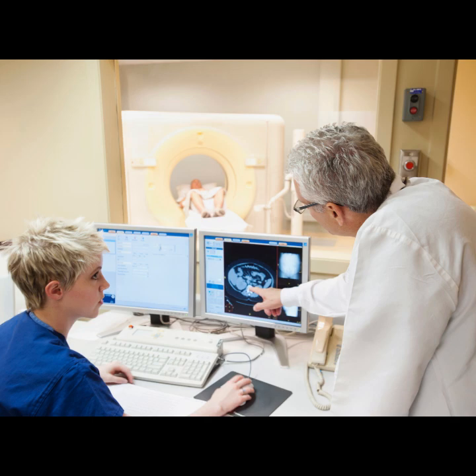Welcome to the debate. Our focus today dives right into the heart of magnetic resonance imaging, the physics and, well, the practical implementation of K-space trajectory creation. We all understand that MR imaging fundamentally relies on encoding spatial information into a frequency domain, K-space, using these controlled magnetic field gradients. Right, and that control is absolutely key.